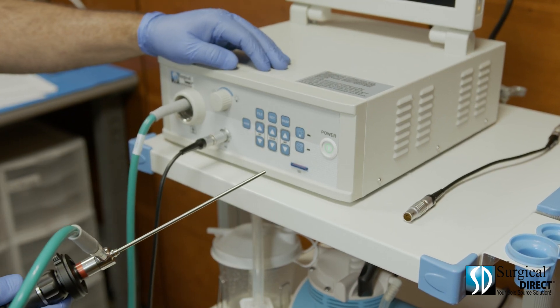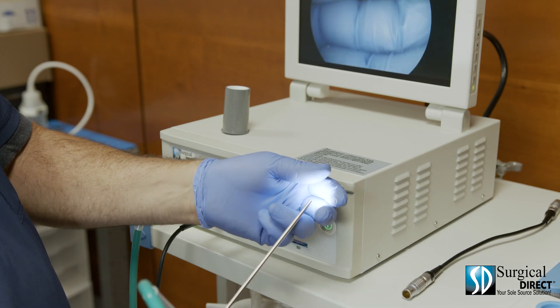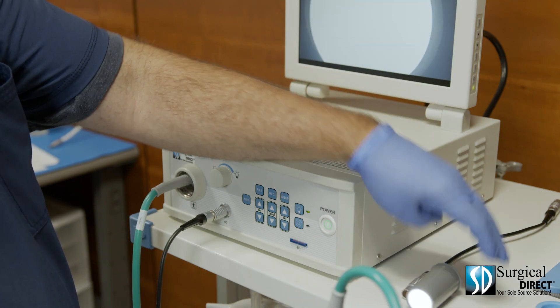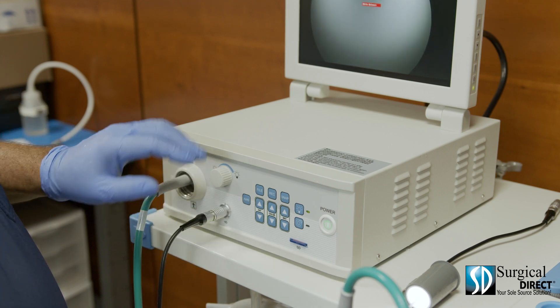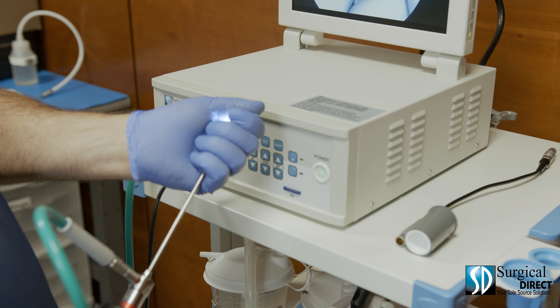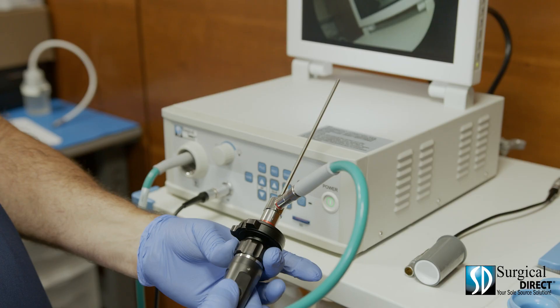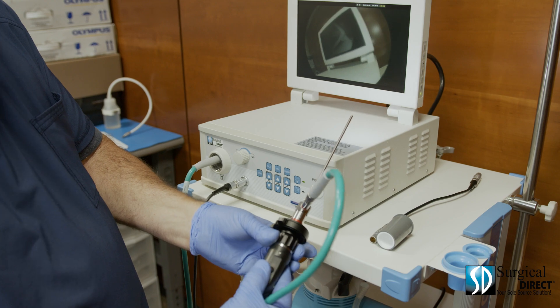Turn on the processor and turn on the light. Next, by either using 4x4s and completely enveloping the tip of the scope or by using a white balance cup, press the white balance button and allow the processor to white balance. The scope is now ready for use. You can take pictures of your procedure by pressing the button, and you can focus the picture by adjusting the focus ring on the camera.